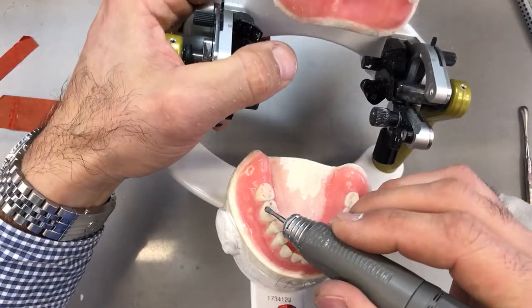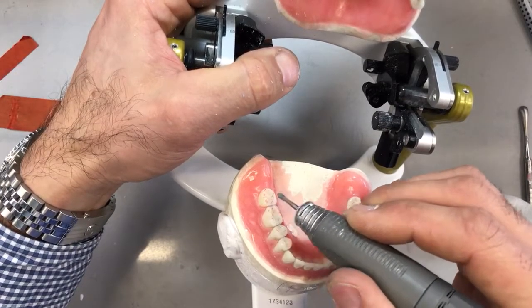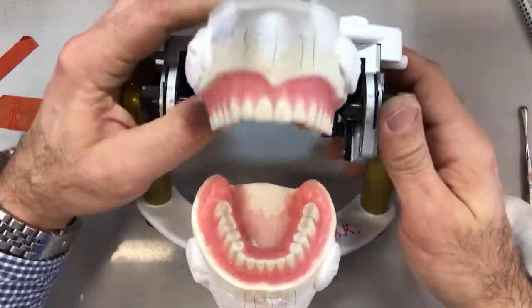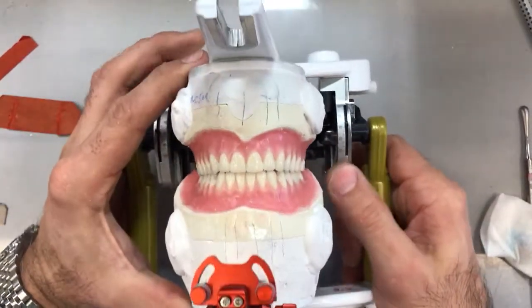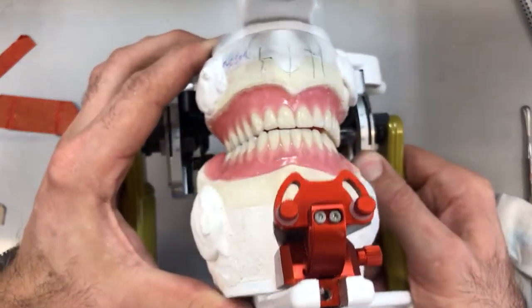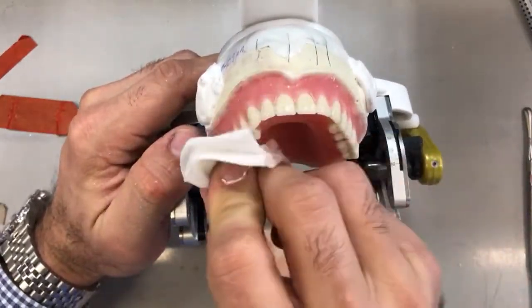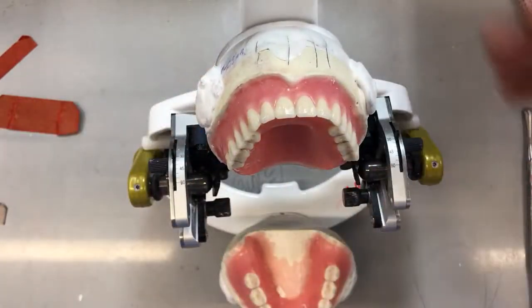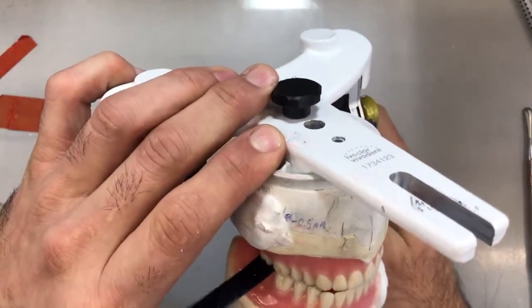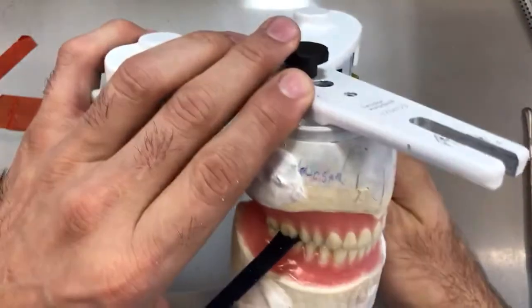If anything, you can work around the buccal-lingual cusp by just rounding it off, but I'm not really trying to reduce it — just ever so slightly rounding off that cusp. Checking it visually again — definitely that shift is now a whole lot smoother, but we're not there yet, so I still need to reduce it some more. I'll get a piece of paper that's a little bit narrower and do it one tooth at a time, placing it between each tooth: between 17, 16, and so on.